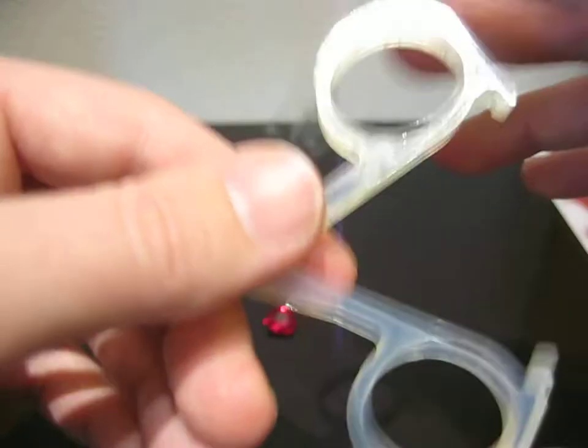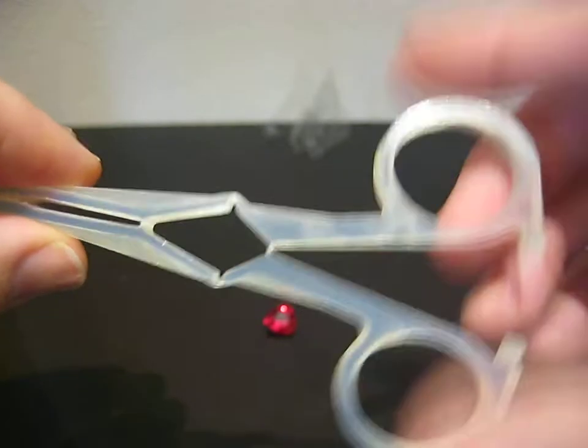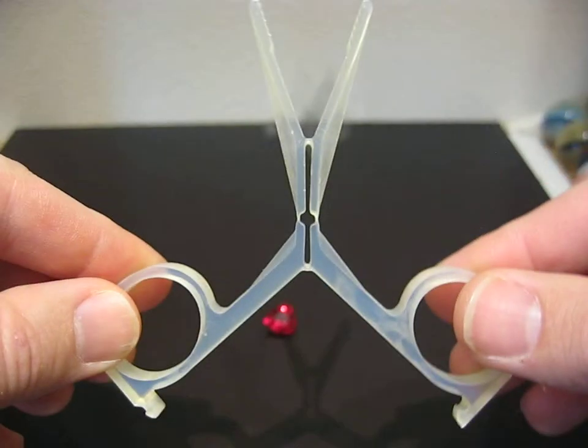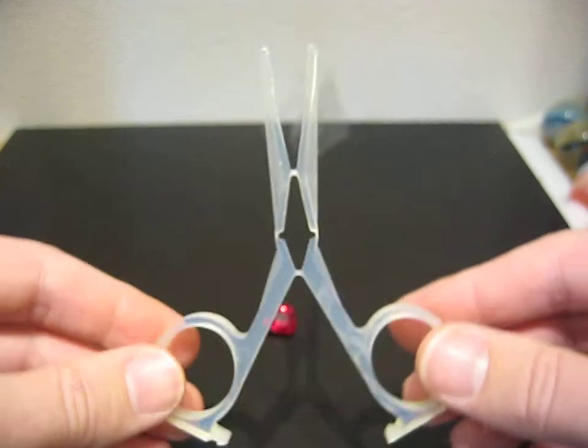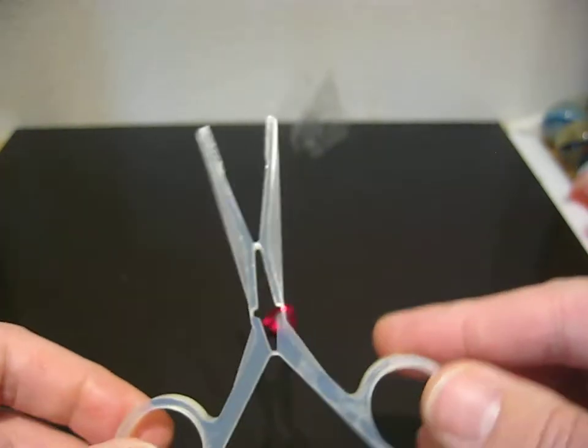When that's torn out, it frees the forceps to operate. When these parts come together, the jaws close.